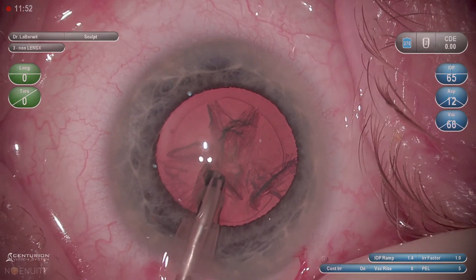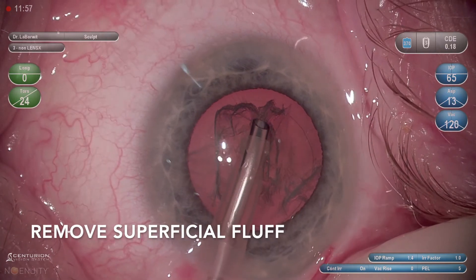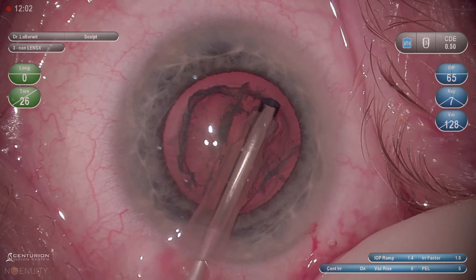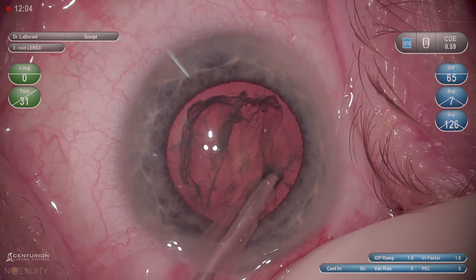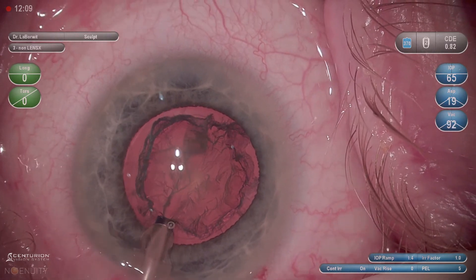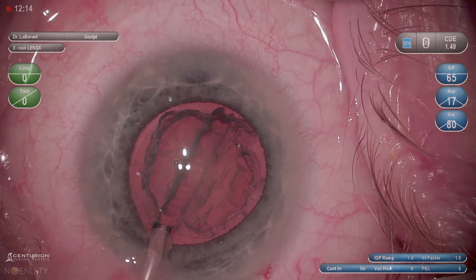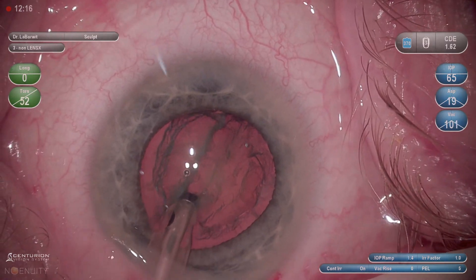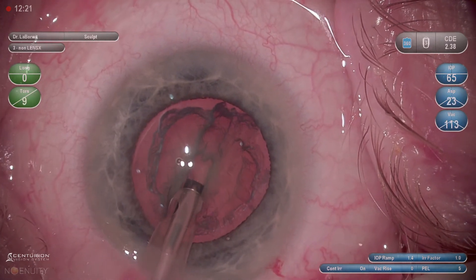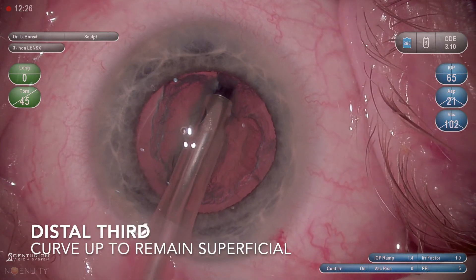Here's another example of creating a groove using sculpting. I'm removing the superficial fluff to improve my visualization and allow for a better red reflex. You'll see that I'm focusing on a steep angle in the proximal third right from the edge of my capsulotomy. By debulking this proximal third, it's going to allow me to more safely approach the middle and distal thirds of my groove, keeping the phaco tip more flat.